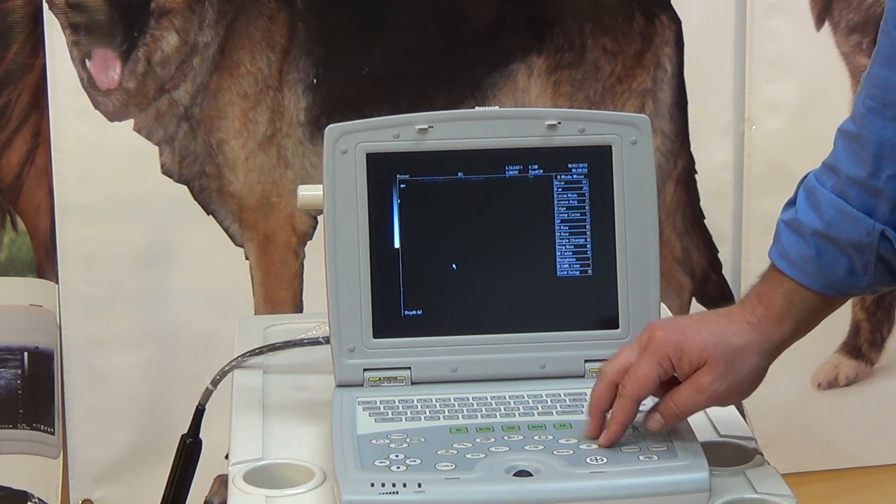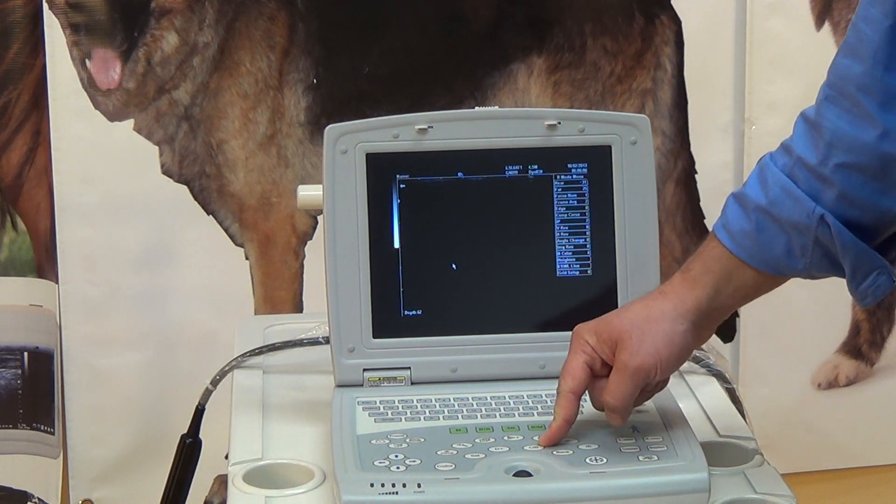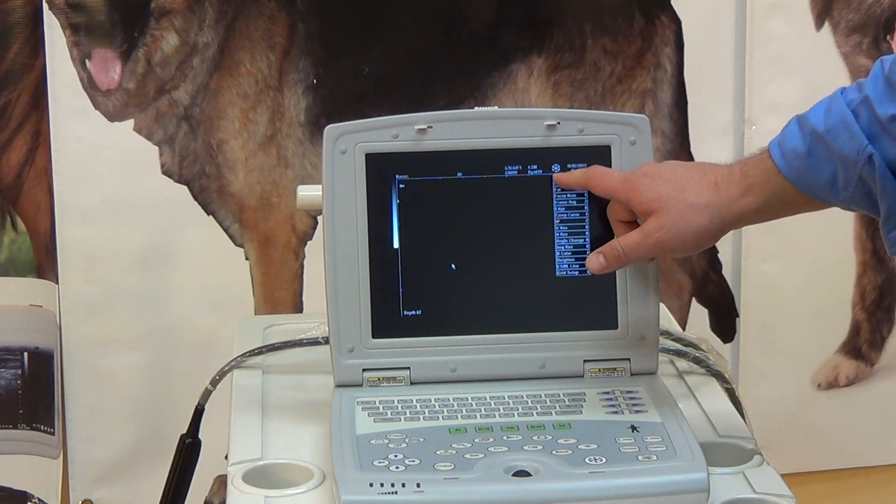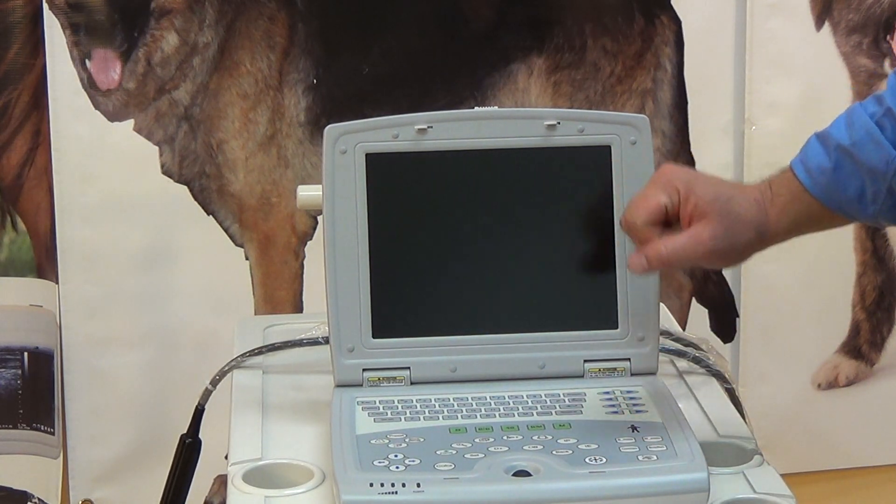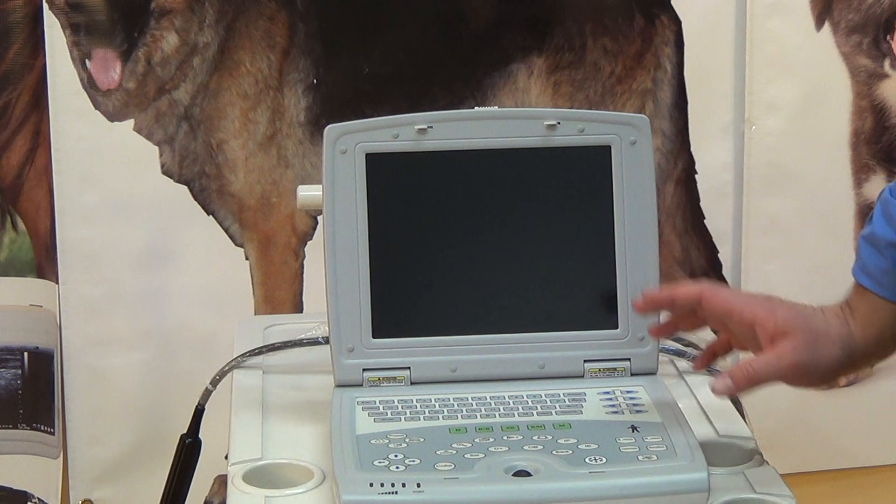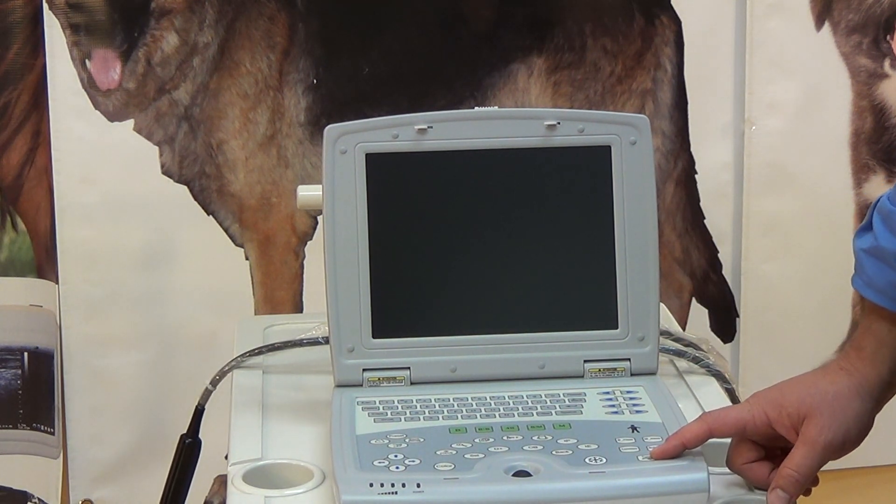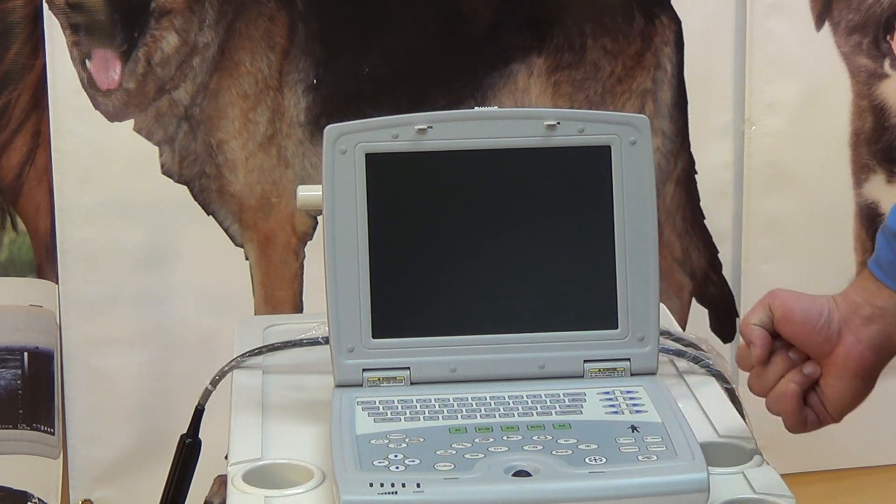You also have an OB calc package, and here's our freeze button, and you can see when it's frozen by the snowflake. Aside from that, we have our standard print button, and that's used for saving the images, self-explanatory.